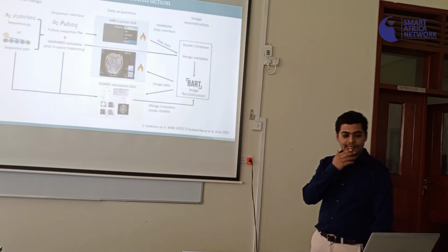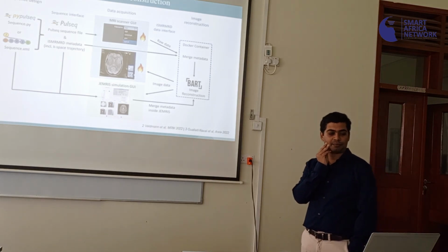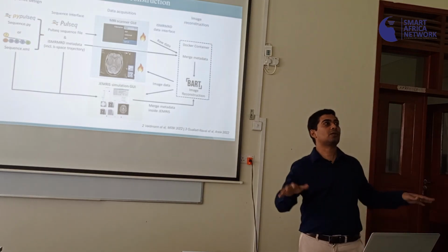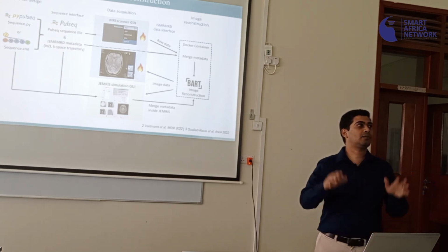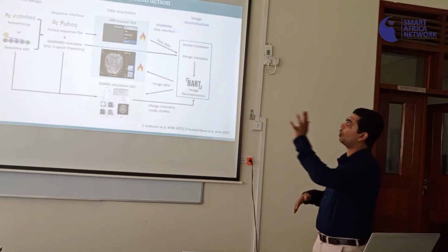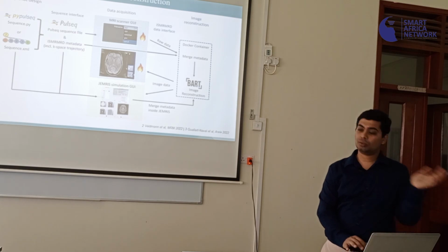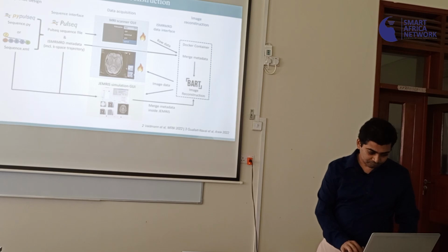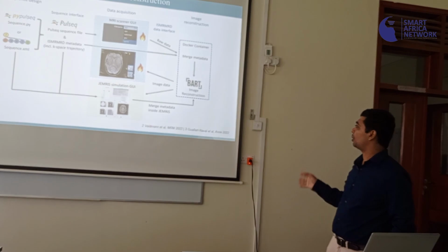So here is a more recent outline that my colleague Maxim and his colleagues have put out, which is, if you were to do all of this open source. You're looking at the hardware, you're building the hardware. Now you think you want to also have the software open source. This is one configuration to put it in. You would use PyPulseq, which is the tool that we've been building, but Maxim's been working on Pulseq. And then you have a bunch of UI options. I'm going to show you another one.